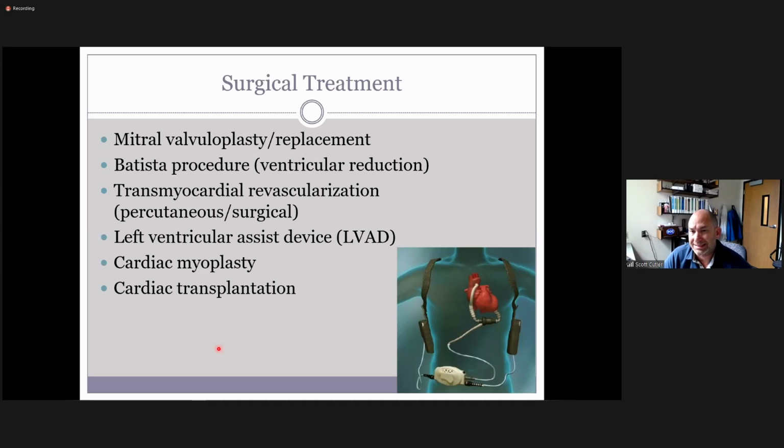The other distinguishing factor between the two is that in both cases you are going to probably have some dilation and shaping differences. A dilated cardiomyopathy can be caused from CAD, but that's when it's more global and you can't tell for sure that it's CAD. We know with CAD that if you see regional segments that are out, that's diagnostic of CAD, even though both have dilated cardiomyopathy.